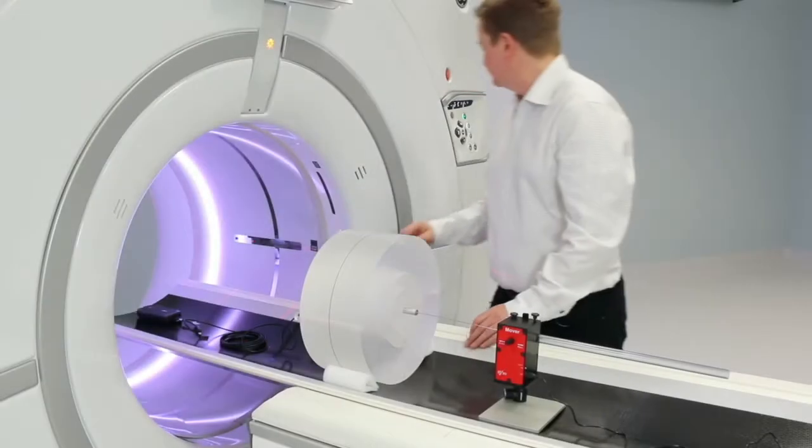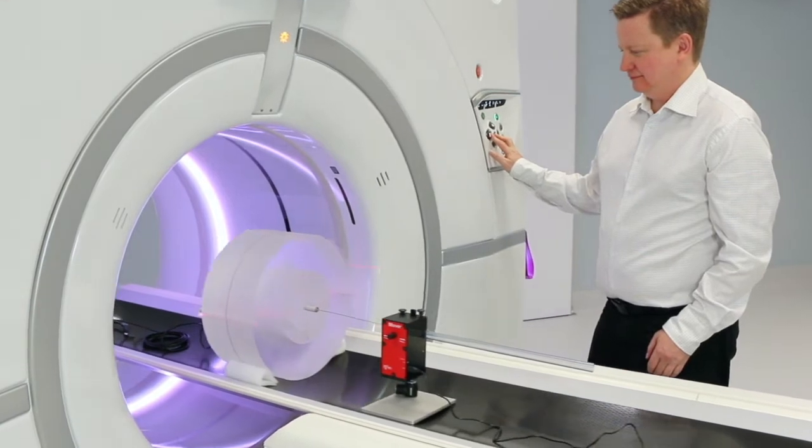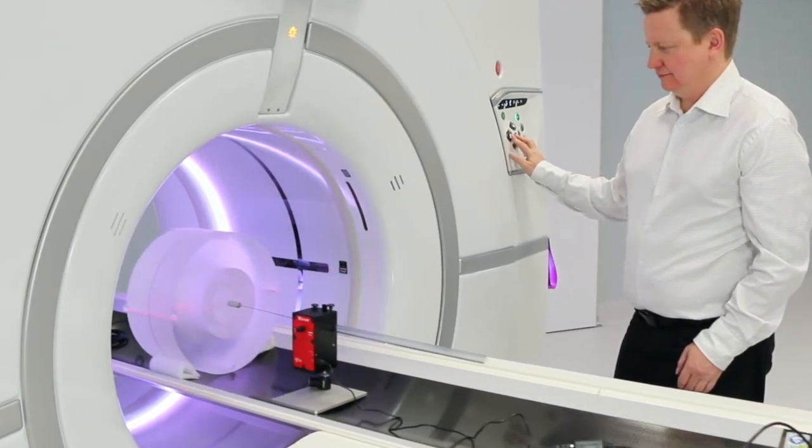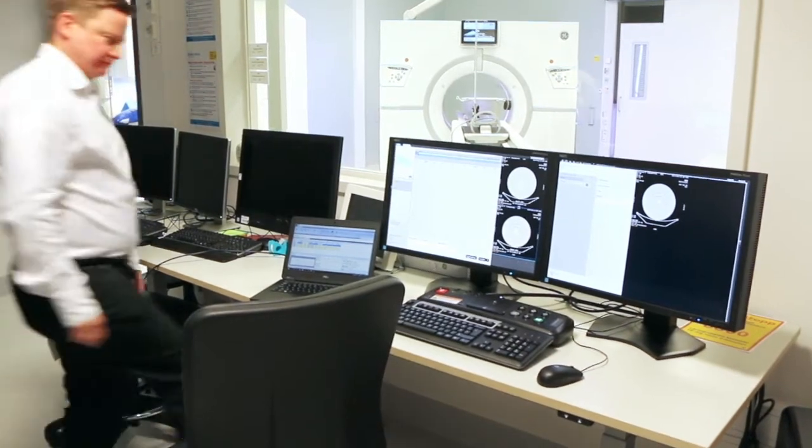When using the mover together with a CT-DI Phantom we recommend that you use a collimation of 40mm or lower. If you want to measure on wider collimations we recommend that you measure free in air.